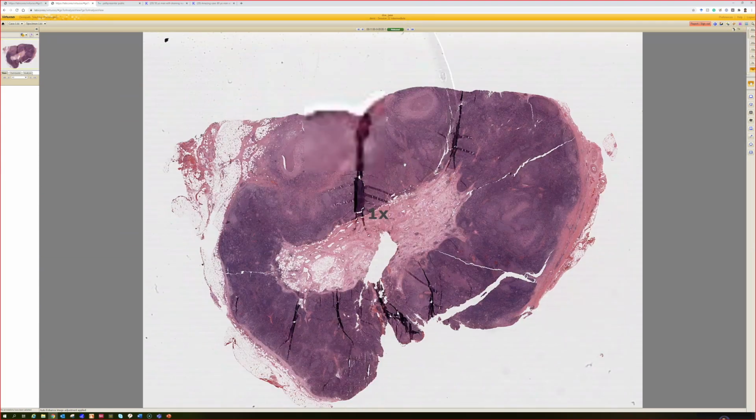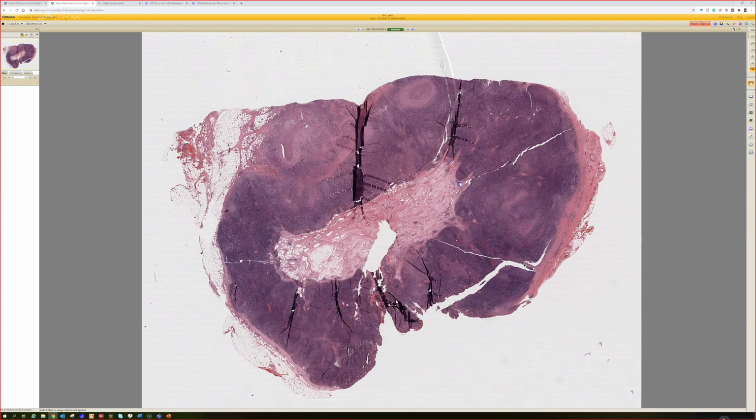All right, case 9. Well, this doesn't look like skin, does it? What is this structure? Oh, come on. I'll edit it out if you're wrong. What's that? Looks like a node. A node. It is. It's a lymph node, right? It's a blue round structure.